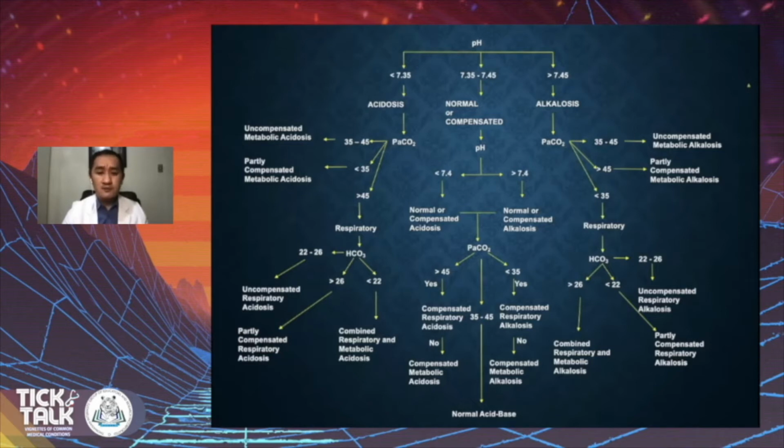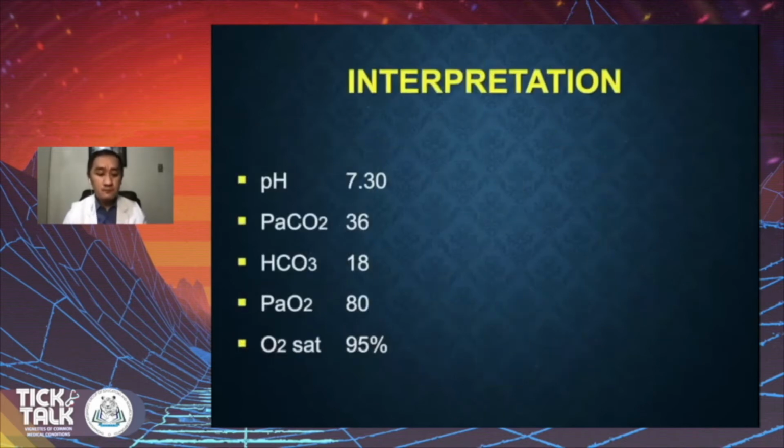This algorithm is very busy, but this will help you interpret the primary disturbance and the corresponding compensatory mechanisms. So let's interpret some ABG results.